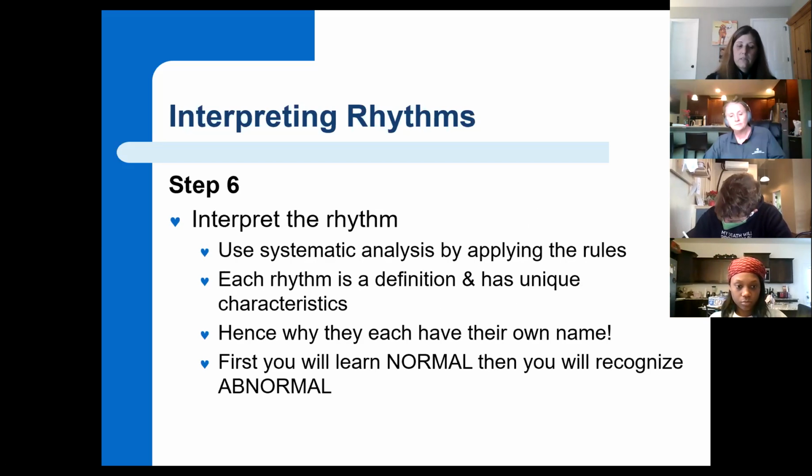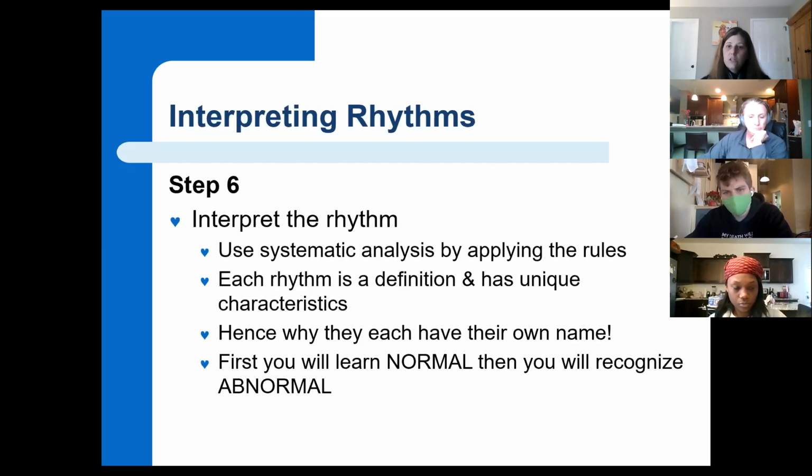Step 6, final step, interpreting the rhythm. So you use the systematic analysis, apply all the rules we talked about, okay? And each rhythm is a definition. It has unique characteristics about it. And that's why they all have their own names.